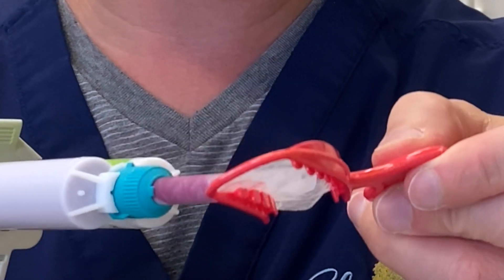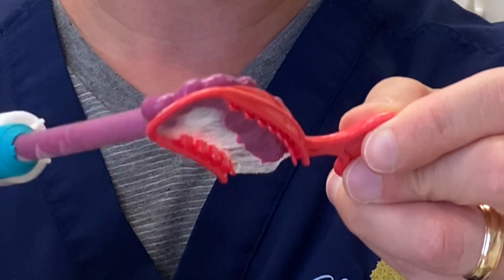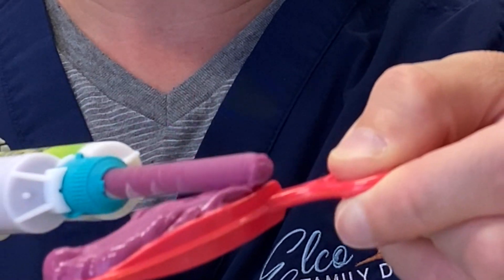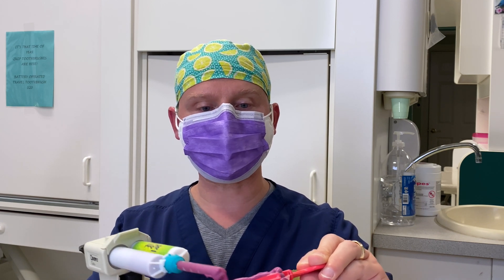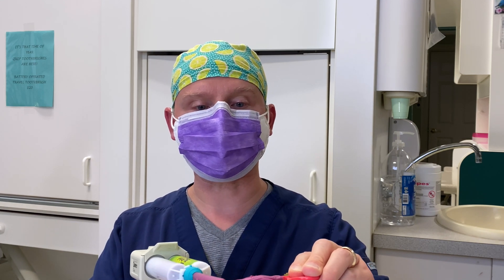So here we are. I've got my tip loaded on and I'm the guinea pig patient. We have the triple tray and the material, which is polyvinyl siloxane — a rubberish based material. We go ahead and pipe the material onto both sides, but you don't want to overload it, just make sure you've got enough. That'll work for that side, then do the same thing for the other side. You can do an impression for a crown, or you could also have the registration of the bite or teeth, and also for making a temporary crown.